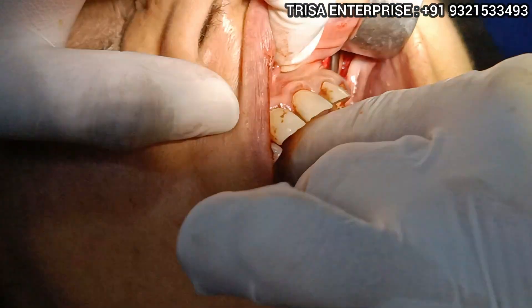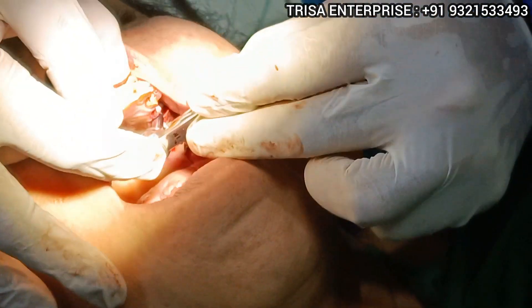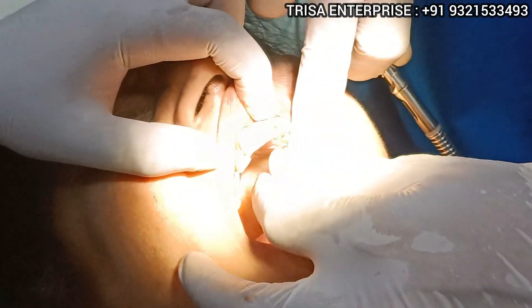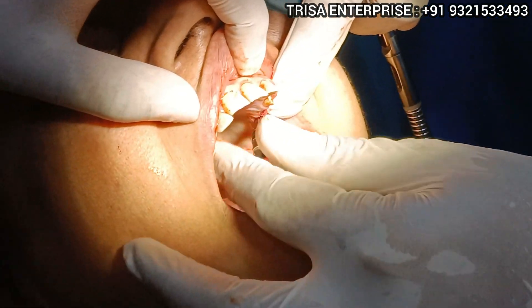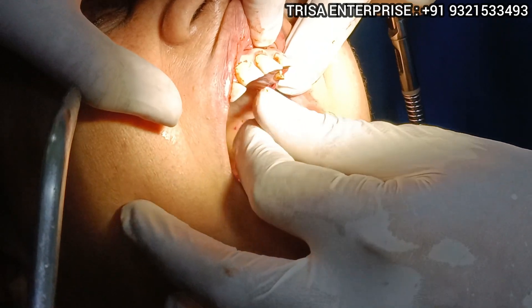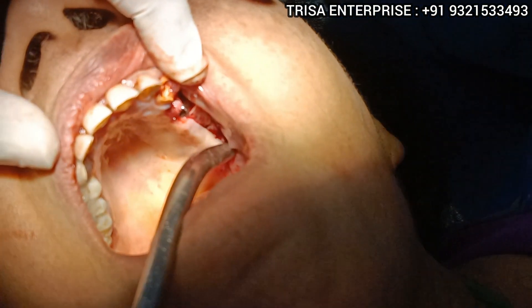You can see how nicely this channel is guiding me into placement of my implant. I can take my driver right here, or if I want to I can even use my hand grip for the placement of this implant. These are multiple options available in the R-line kit — depending upon what is suiting your workflow, you can use either.